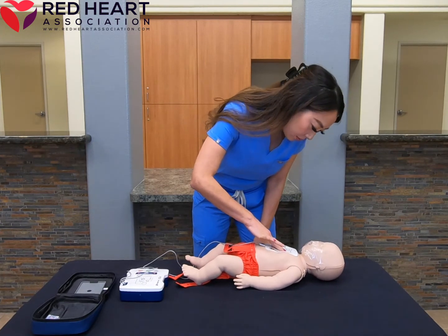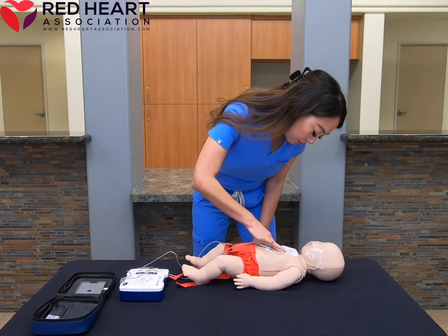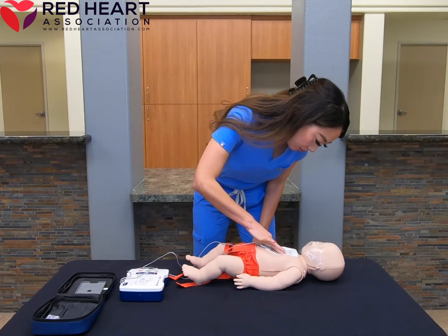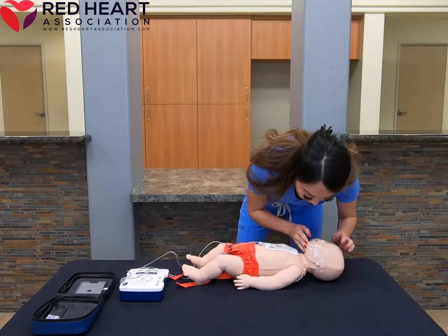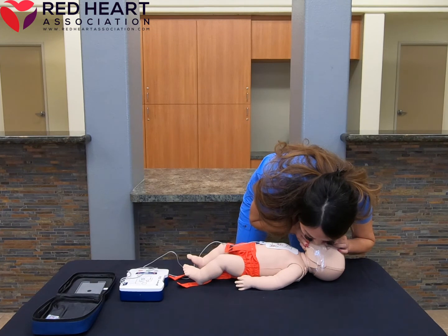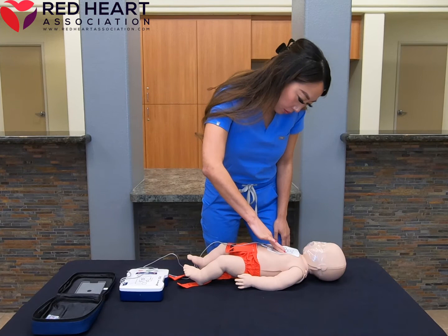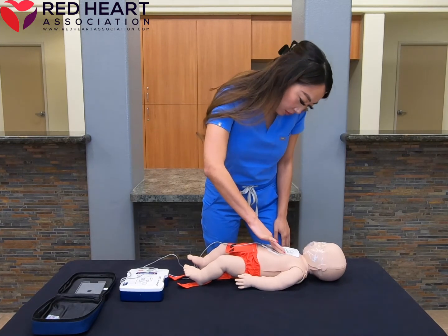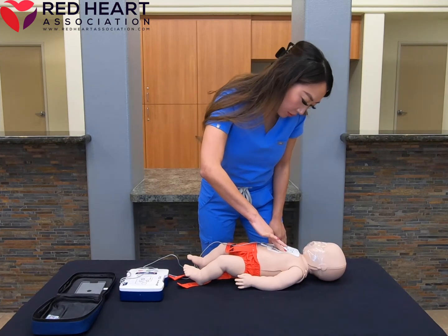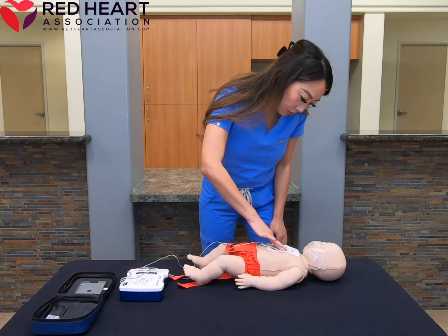10. 20. 30. Give 2 breaths. 10. 20. 30. Give 2 breaths.